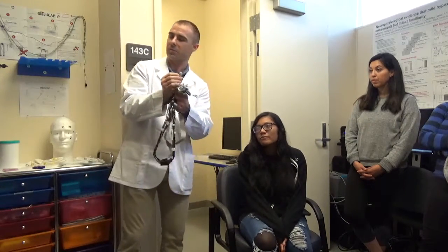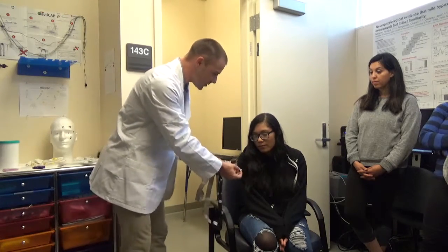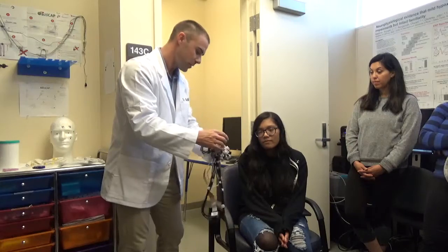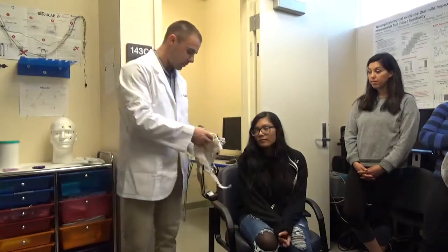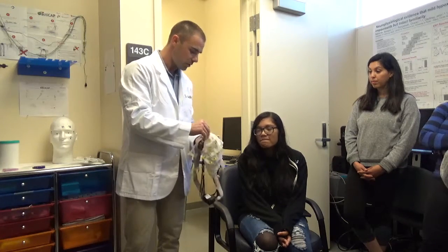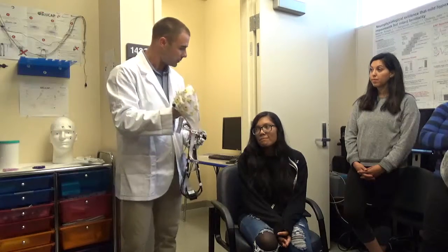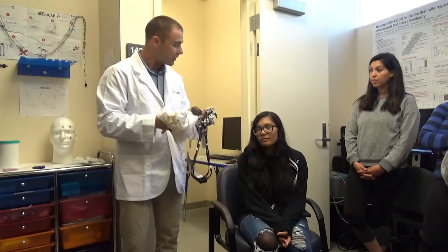These are our little electrodes. See that little metal piece? That's all it is, just flat. You want to touch it? It's not sharp, right? And so it'll rest essentially right above your skin, kind of like that. And these little holes just get held in place in these little nodules. And it's really that easy. So, what we'll do is we'll first set this cap up on your head, and then ultimately we're going to plug these different electrodes into these spots.